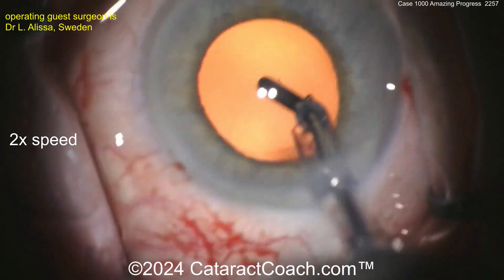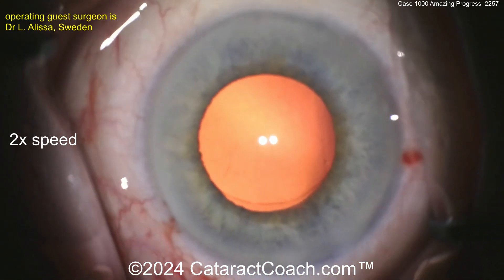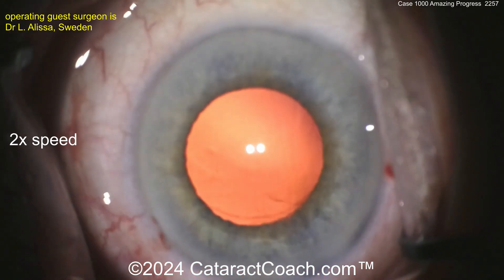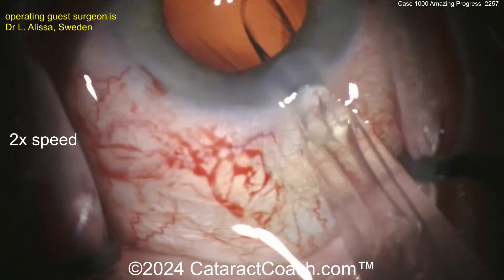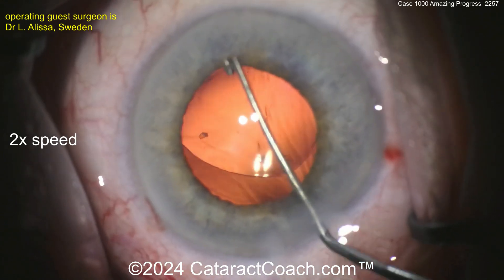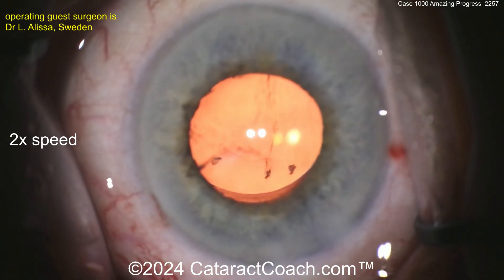Once it's cleaned up, let's see what we're going to do for the lens. In a case like this, I'll also go in with a chopper and lift up the iris — after getting the IA out of the bag with the AC full of viscoelastic, use the chopper to lift the iris and make sure no lens material pieces are underneath it and no cortex is left in the bag. Viscoelastic in — probably a cohesive agent. Here comes the lens, looks like a single-piece acrylic, get that in the capsule bag. That's about a five-millimeter pupil, so that rhexis, which you thought looked too big, is just about perfect. Using an instrument to lift up that iris just to make sure nothing's remaining there.